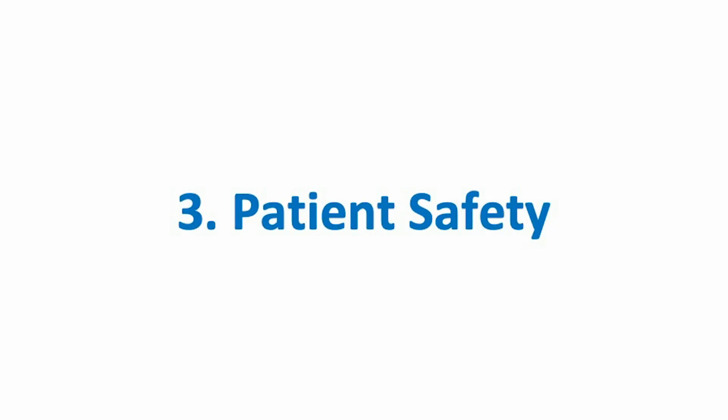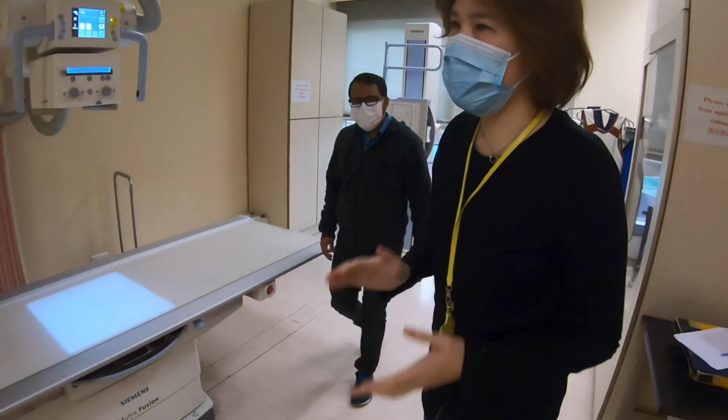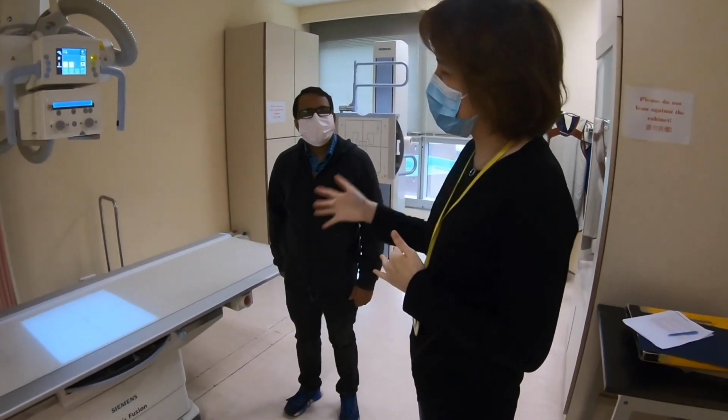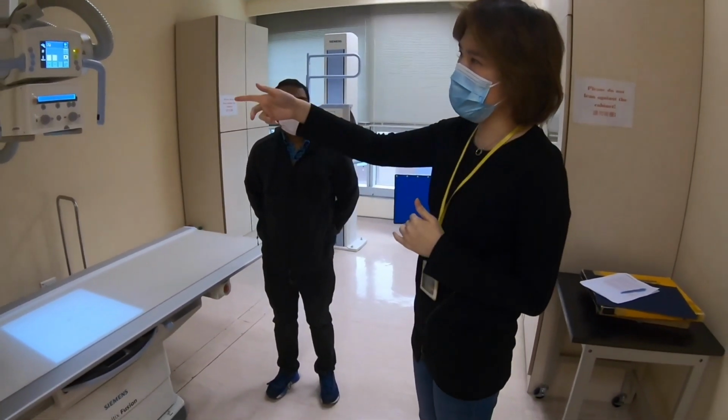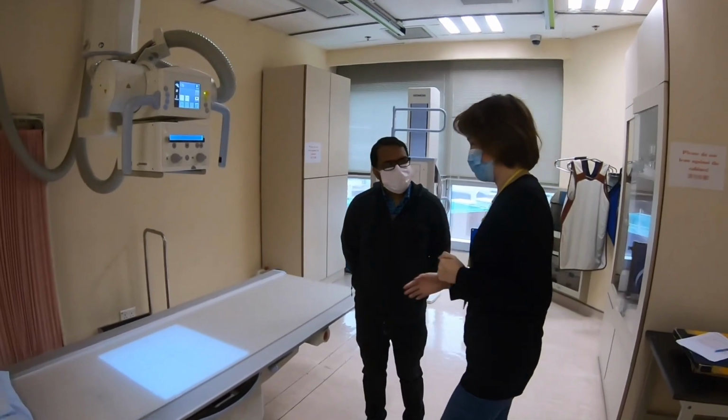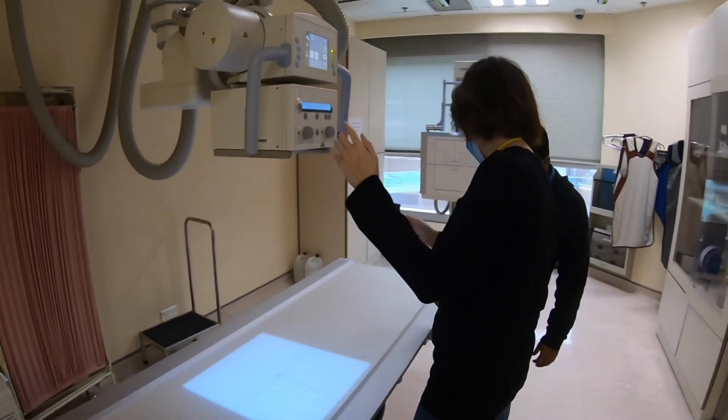Patient safety. So to ensure patient safety, it's very important that when we ask the patient to lie down, we need to raise up our X-ray tube and then lower the couch for him. So can you please take off your shoes?